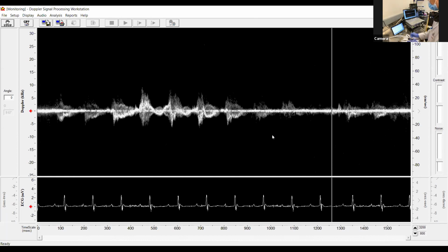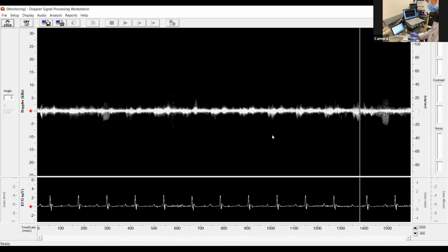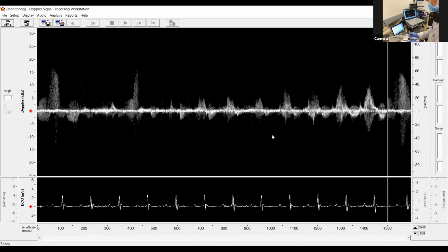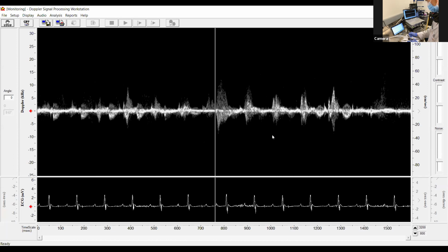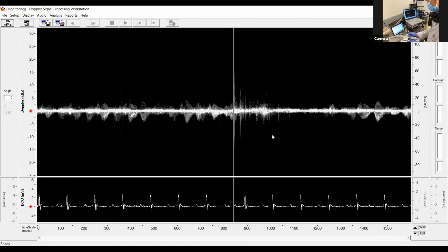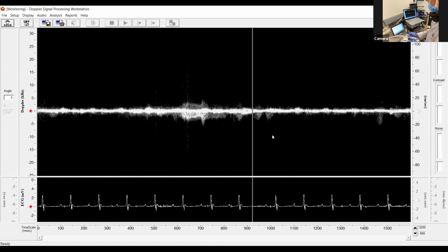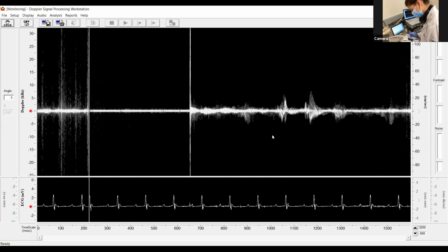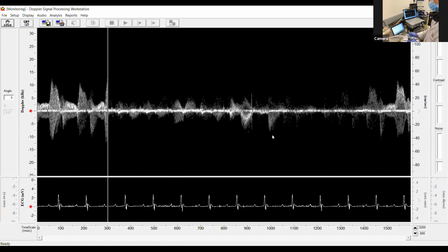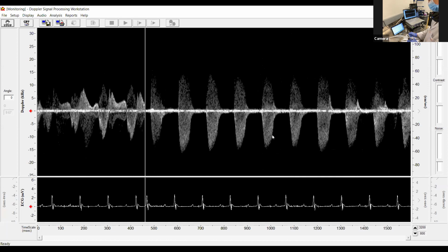But given what we're seeing and where Sydney is, I actually think what we were seeing as having a low E and a high A peak all throughout is actually the mitral valve in these animals. So these are animals that are coming from a breeding colony with a specific genetic mutation. These ones are supposed to be transgenics, but with not the full genotype that they're looking for. But it looks like there's some differences going on in these hearts, which we weren't necessarily expecting. But again, the fun things that we run into when doing a live virtual demo.